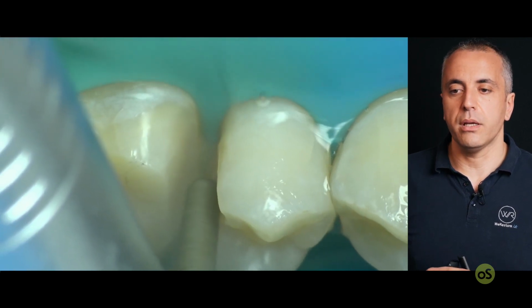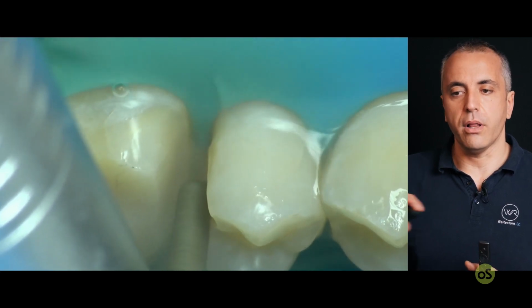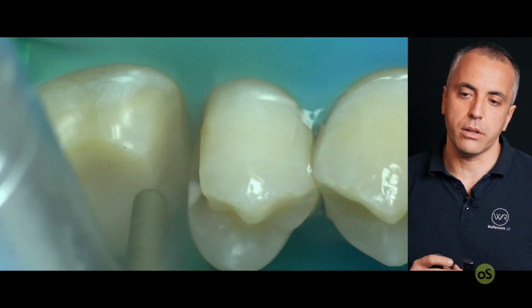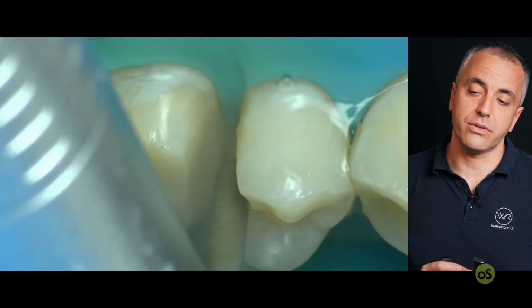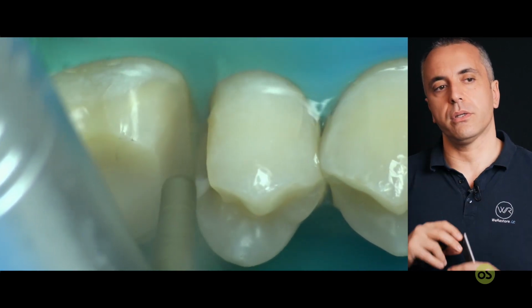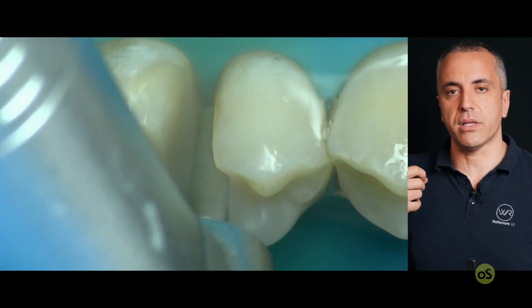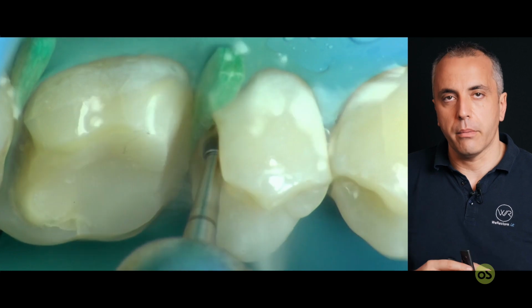In this preparation, you see, there is the demineralization we have to prepare. The demineralization follows the path of the decay that goes down the dentin, then from the enamel dentin junction goes towards the pulp. This is a very nice vision of the demineralized structure and how a lesion from the smooth surfaces goes inside the tooth. So from a big surface towards a smaller one. Instead, caries on the sulcus, on the grooves, start from a little part and becomes bigger.